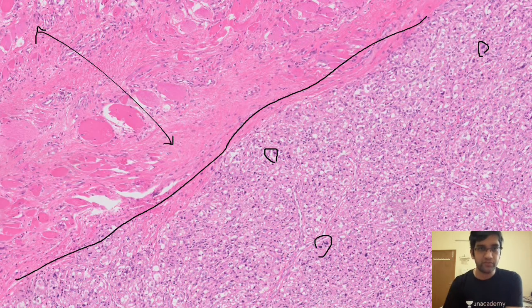So I do have lots of pleomorphism. So I think of a malignant lesion in the dermis, most likely arising from any of the mesenchymal tissue, most likely a sarcoma. More than a benign tumor, I think of a sarcoma. And the next thing which you can appreciate here clearly is lots of clear areas, right? So when I have clear areas, it could be anything. There's clear cell sarcoma, which comes from the top of my mind. It's a melanoma of soft parts. It could be a melanoma itself. It's the greatest mimicker of everything, right? So I have different possibilities here in this image.